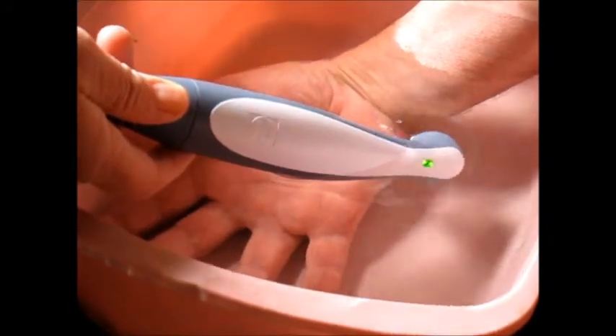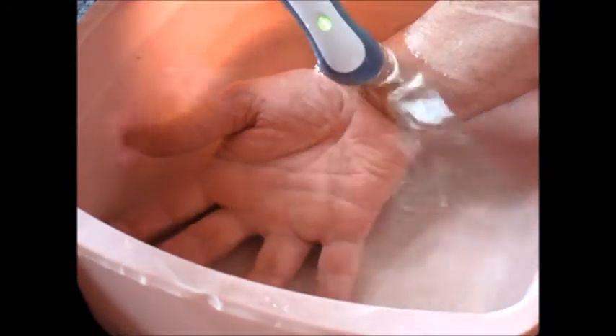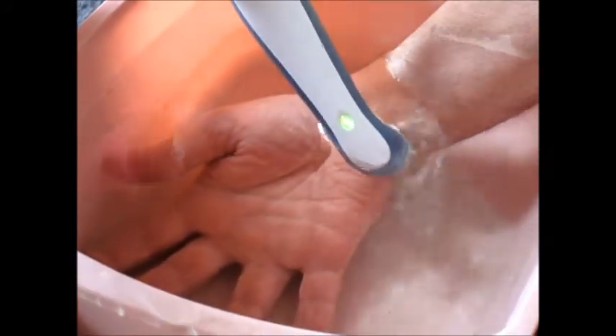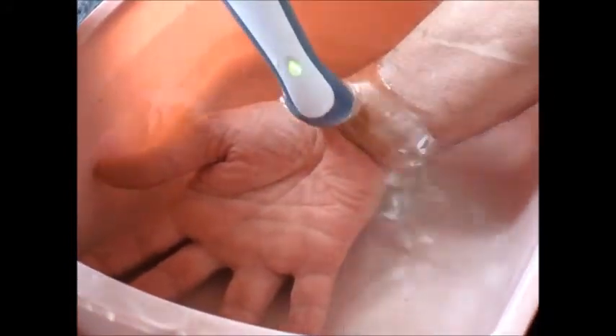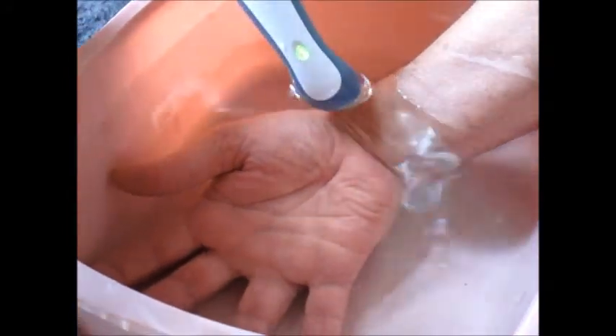At 20% duty cycle, there's no risk of a burn because it's only 20% duty cycle. 100% will give you heat — the deep heat of ultrasound. You don't want to touch the skin while you're doing the ultrasound.